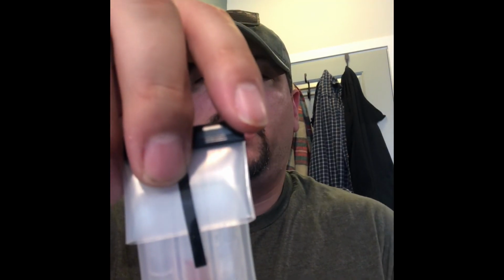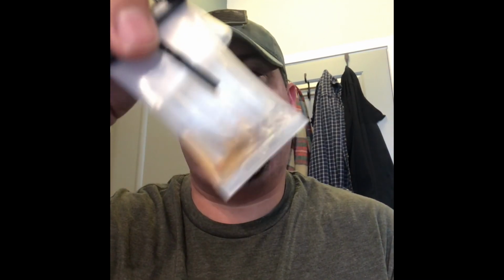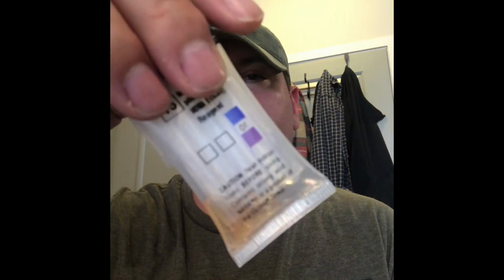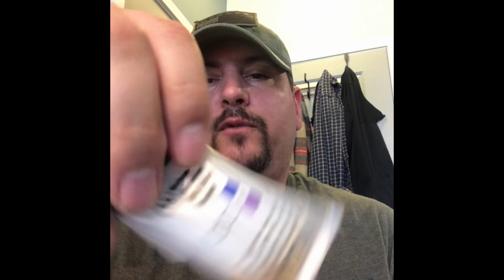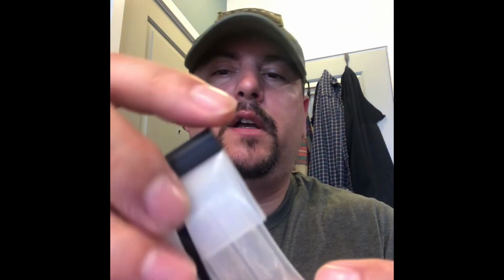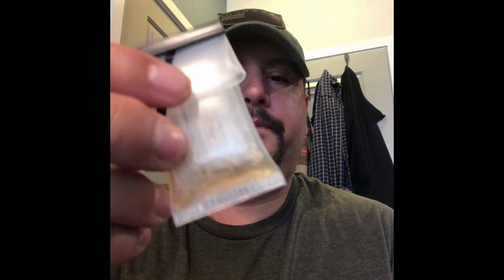Now, like I said, break the center one next. It's got that off-colored orangey liquid in it, if you could see that. So you break that next. What do you think is going to happen? Yes, it's going to turn orange. That's obvious because the thing was orange to begin with. Not super orange, but with the meth, it's got to turn blue or purple. It's not any of those things. Now let's see what happens when I introduce the third liquid from the third ampule.